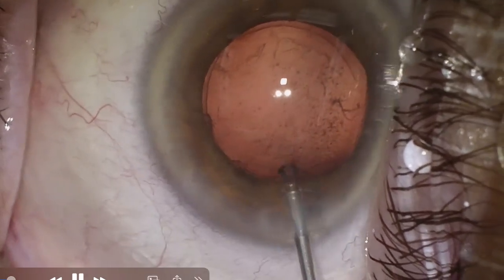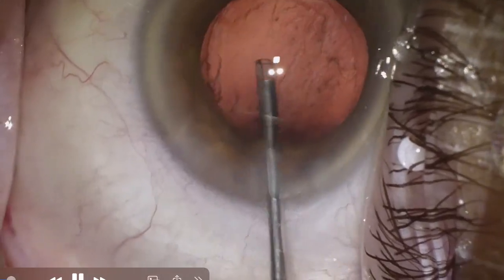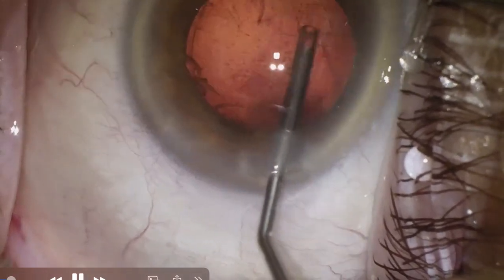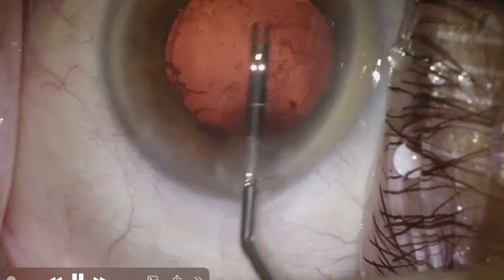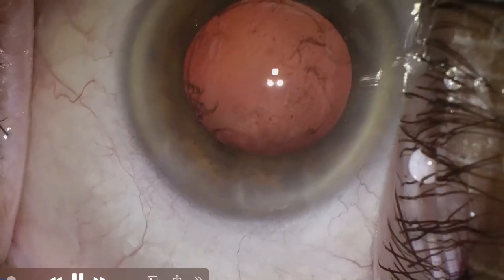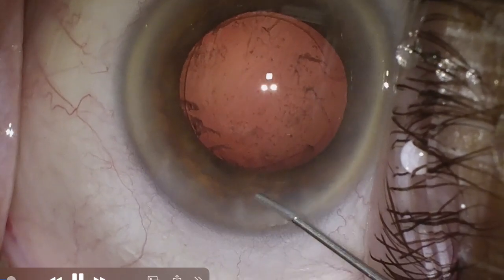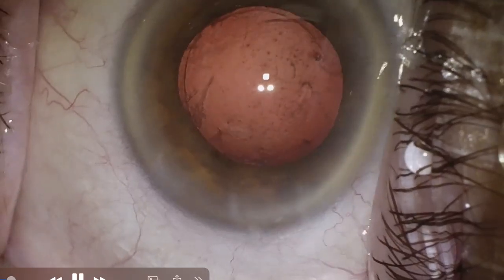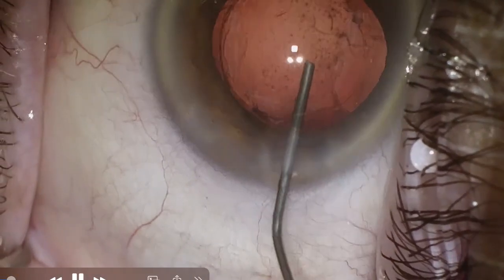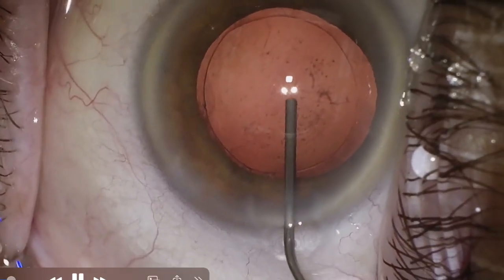Nonetheless, I'm going to go in with my Terry squeegee, and yes, we do have some strands there attached to the posterior capsule. The Terry squeegee very effectively cleans off the central posterior capsule, removes any cortical fragments off the posterior capsule centrally. And now we'll go in with Provisc. I will inject to the left and to the right of the wound, and that way if there's any nuclear pieces or cortical pieces hiding in the anterior chamber angle, we can get those out and remove those when we do IA.